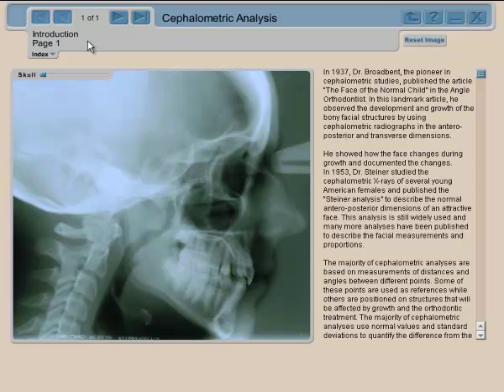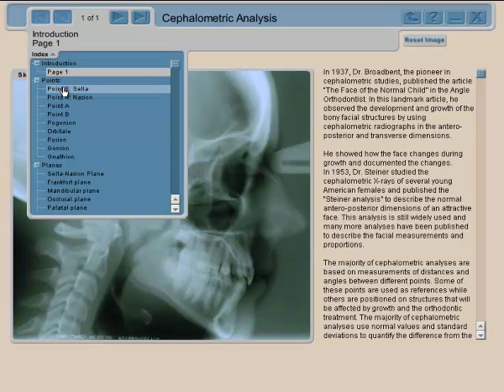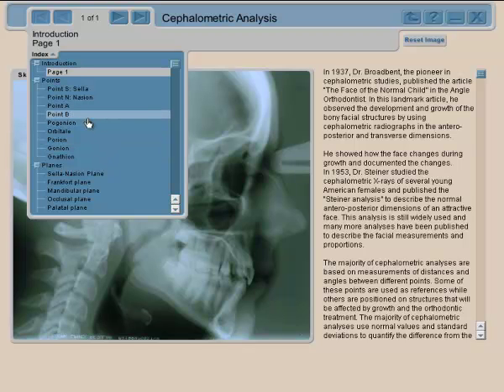Now that we've seen the introduction to cephalometric analysis, let's see what we can do. The first thing is to find some points. This analysis uses Tweed points, Steiner, the Wits analysis, and Down — so it's not a fully complete analysis, but it gives you an idea.